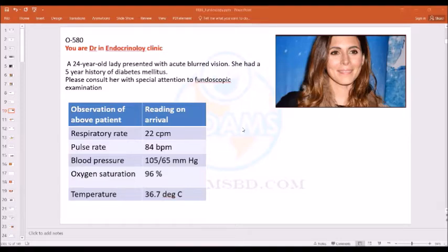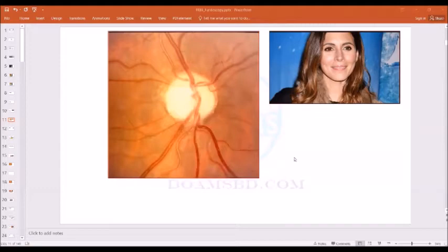Okay. Now I am examining you with this torch. It is a torch. It will not harm you, but it will be a little discomfort. Is it okay, doctor? Okay, doctor. Now I am approaching the patient from 1 meter apart, and the red reflex is normal. The red reflex is there, so there is no opacity. So this is the retina inside. So what are you getting, doctor? Can you tell your finding actually?